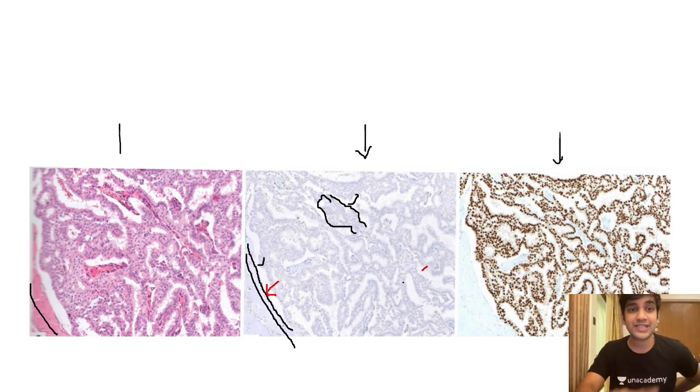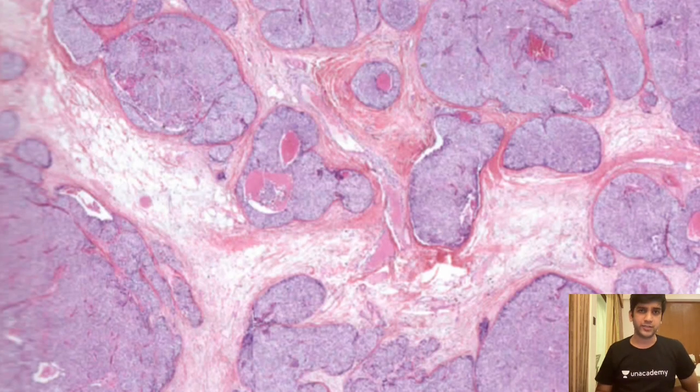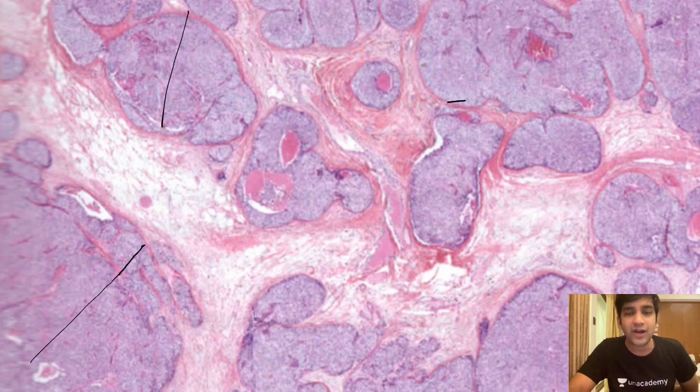Fine. So this is how your encapsulated papillary carcinoma will look. The difference between this and your solid papillary carcinoma is the architecture. See, it is solid. It's undoubtedly solid, right? On a low power, I cannot appreciate papillae. That's what our case was. On a low power, I was not able to appreciate the papillae, right? I hope it is clear now.